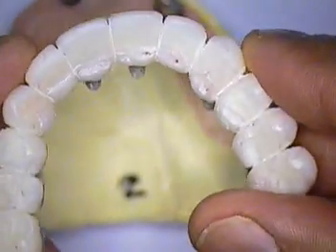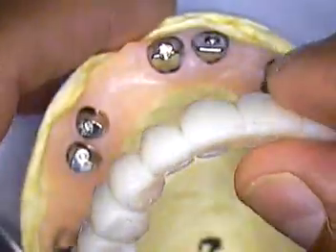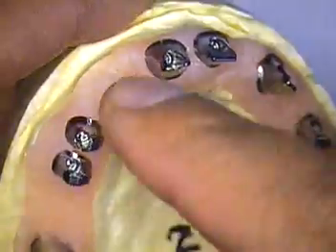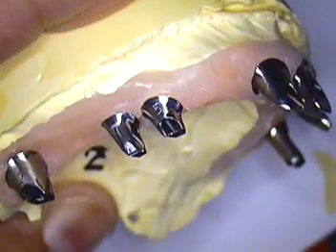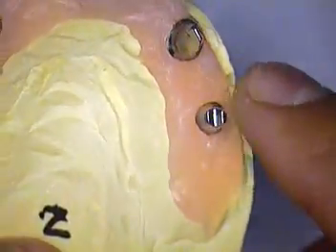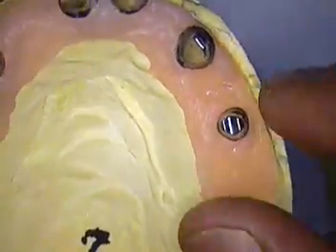This was our mock-up. We did select to use a durable material called Triad Composite. That was fitted to the MasterCast and then the computer scanned this and virtually made the abutments, which then were sent to me via email. I was able to use the software — discussed on an earlier video — in order to have these finished and milled. We found out that this abutment and this one were a little bit too small, too short, and too thin.